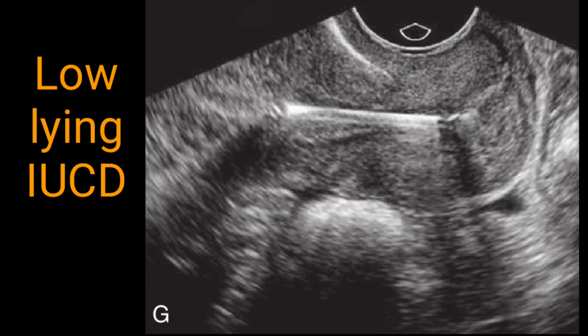This transvaginal scan is another example of the low-lying IUCD. As I mentioned earlier, there are three categories. Either the IUCD would be in normal position, so you can mention that the IUCD is normal in situ, or the second possibility is that there will be a low-lying IUCD. So here you can see this IUCD in the lower segment of the uterus, and part of the IUCD can be seen in the cervical cavity as well. It means that if it is a copper T, both arms would be embedded in the lower uterine segment myometrial stroma.